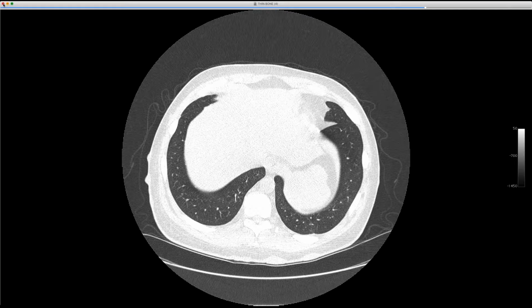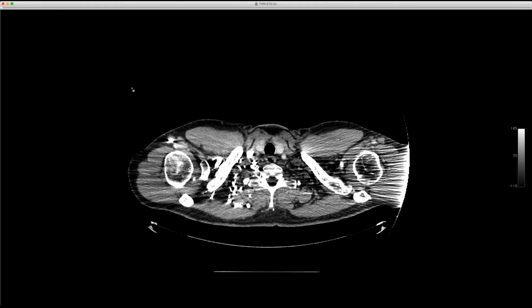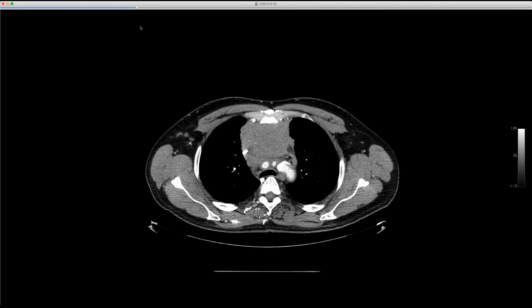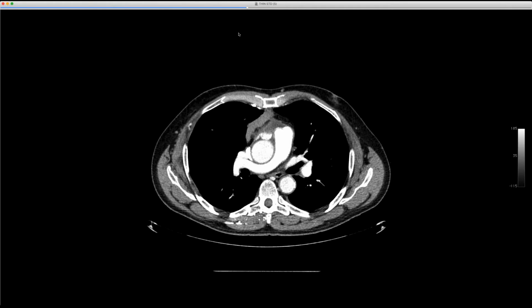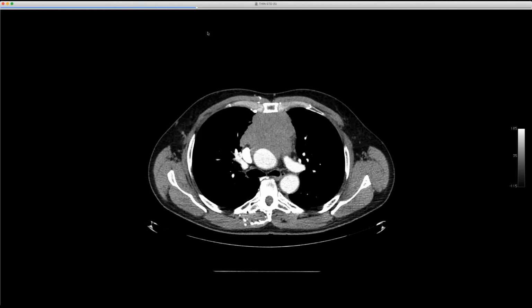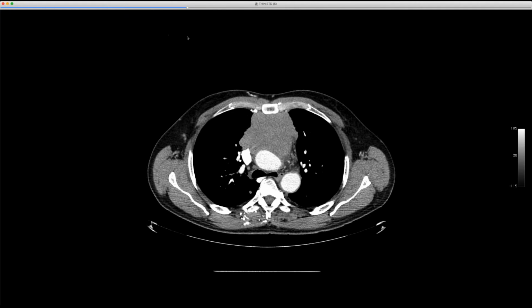Yeah. So now this is cool, and I have not seen this with this particular cancer. I'm going to show the screen. This is a guy who presented with SVC syndrome back in May, and had a mediastinal mass, had a stent put in to relieve his symptoms. And here's the CT that was done 2 weeks before that radiograph. I don't have a pre-radiograph, but it gets the point across. So here's this big, ugly, infiltrating mass in the prevascular mediastinum. Thymic neoplasm, maybe a small cell, something else bad. This ended up being thymic carcinoma, which doesn't surprise us given how aggressive it looks.